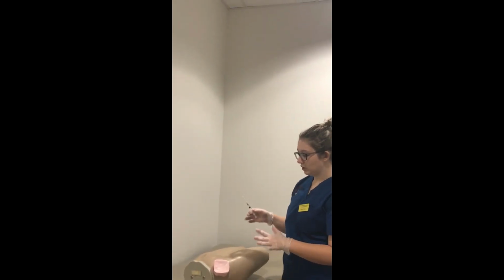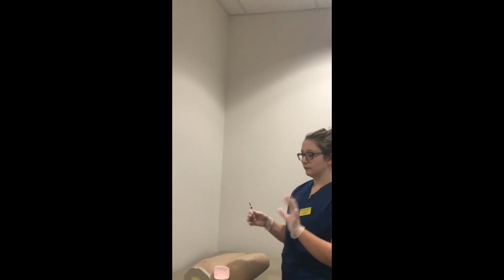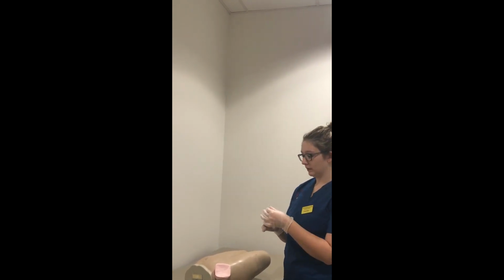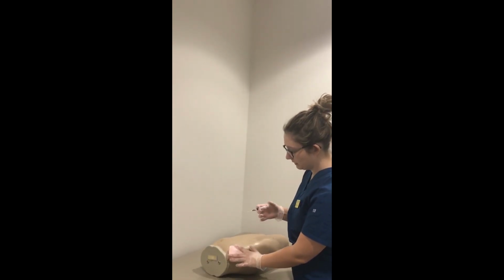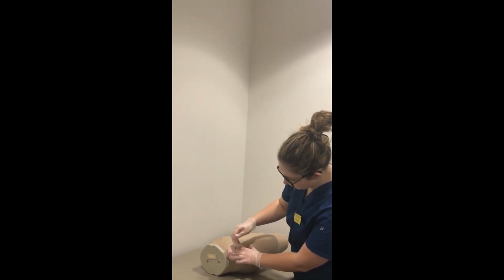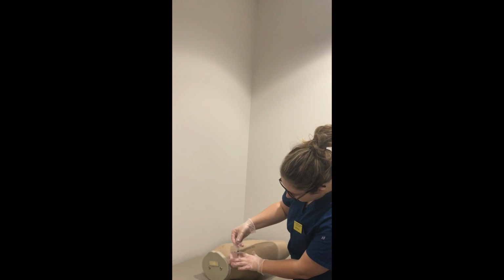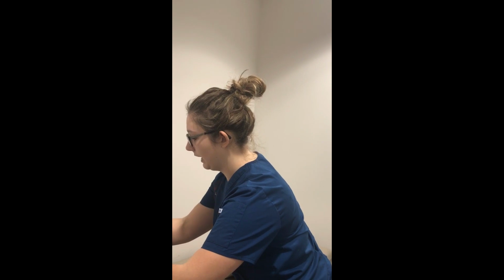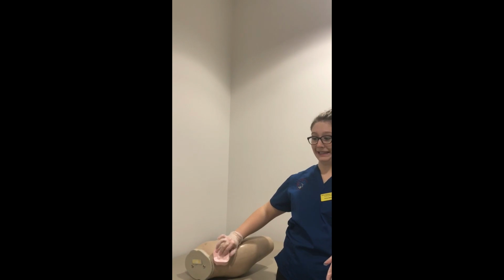So I will explain to the patient that this shouldn't cause any pain, but it should be like a sharp poke, and that if they feel any increased pain, to let me know. So I will remove the plastic, place my hand, and then I'm going to be going in at a 90-degree angle. I will slightly draw back to ensure that there is no blood, so that I haven't hit a blood vessel, and then I will continue with the injection. I'll put the cap back on, and then provide the client with a piece of gauze to apply pressure in case there is slight bleeding.